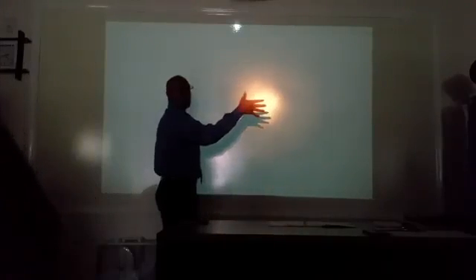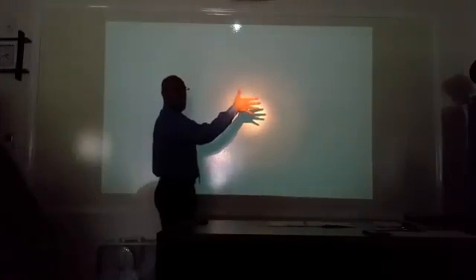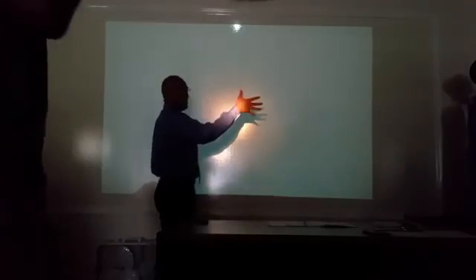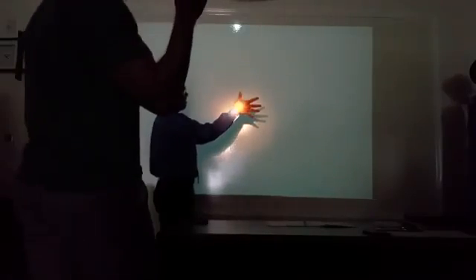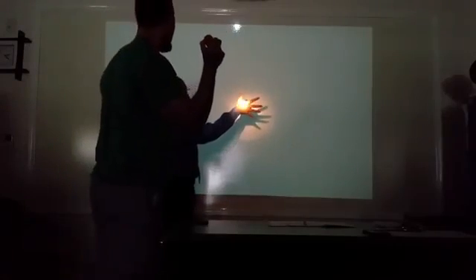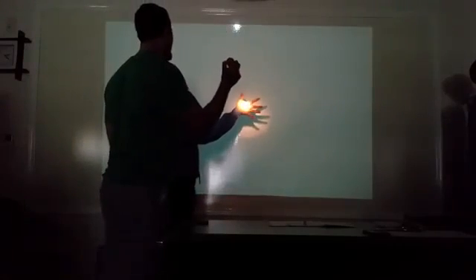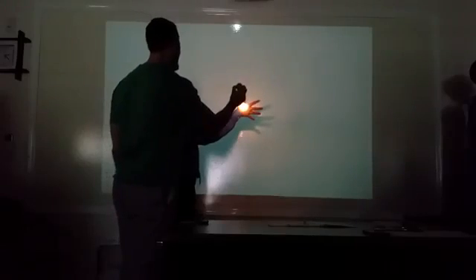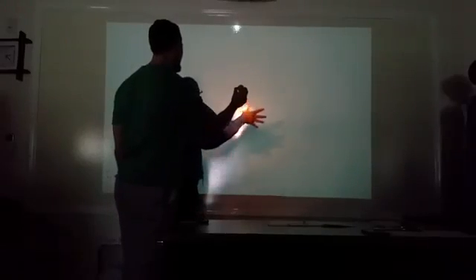Okay, so the further that you bring your tube away, the less magnification you have. Bring it closer. What does magnification do to detail? Look at the edges of my hand. Decreases detail. So now my hand is getting bigger, right? Everybody agree? And look at the detail of the edges of my hand. Blurry. So magnification, good or bad? It's bad. Okay, so anytime you have magnification, you lose detail.